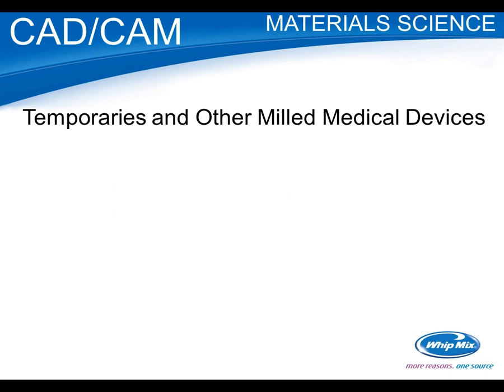Other materials: temporaries have really started evolving. In the past, I don't think this was something that it was easy for a lab to provide. It's not practical to work with PMMA as it is, or some of these others. But now that you have CAD/CAM, that gives you a new offering that you can provide back to your dentist. And in a lot of cases, it's not practical for the lab to produce the temporary. It's easier to do that chairside.